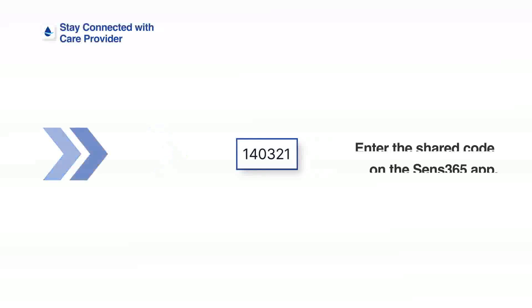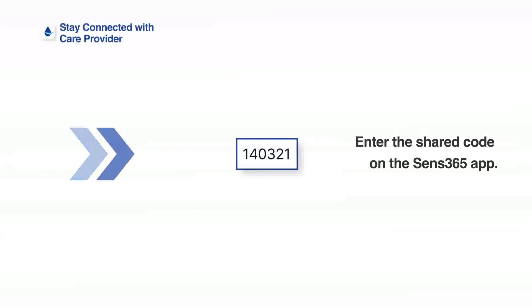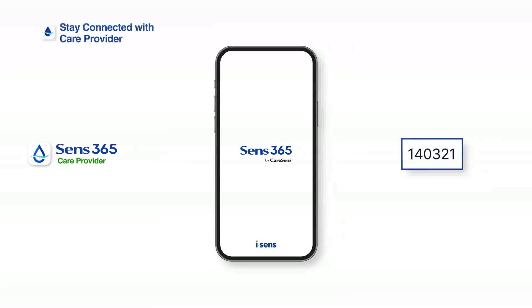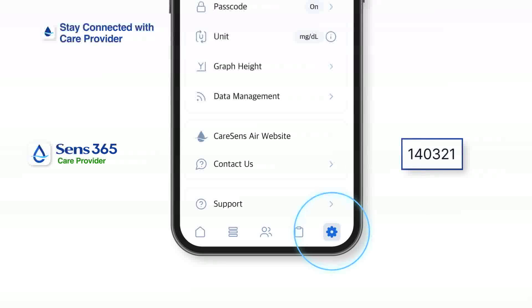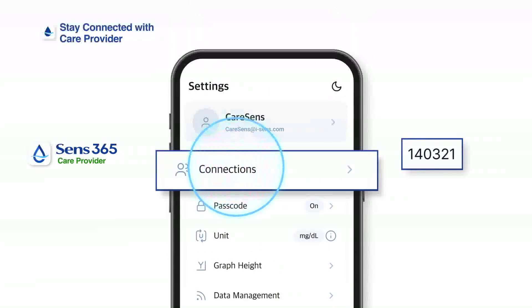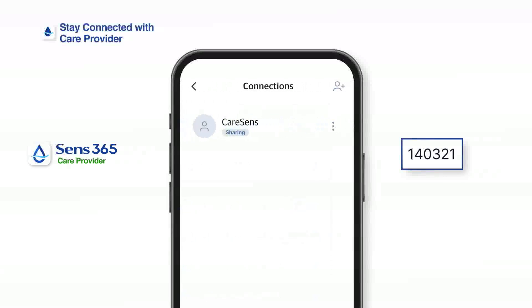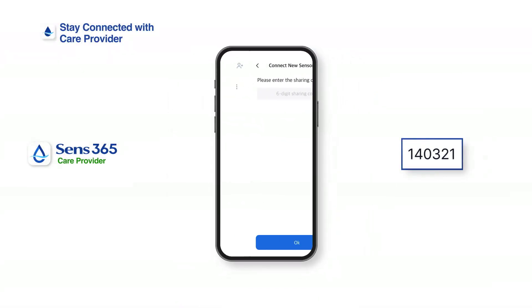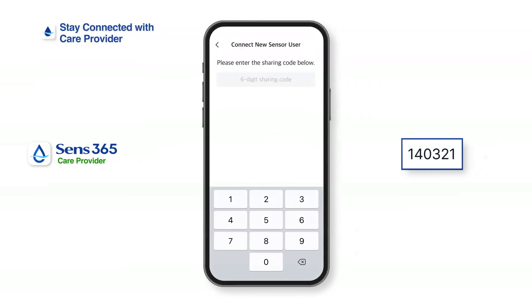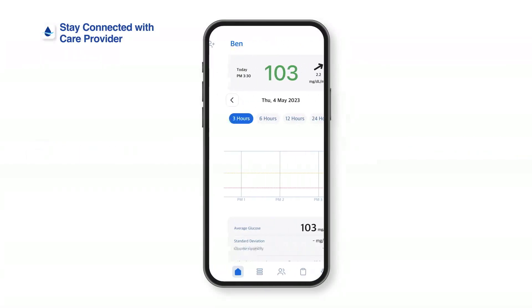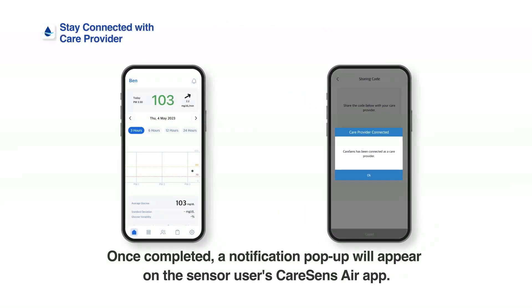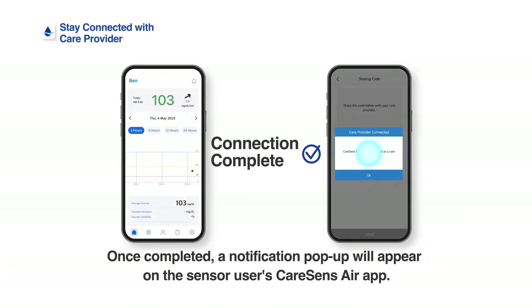Now, let's enter the shared code on the Sense 365 app. After running the Sense 365 app on the care provider's smart device, tap Settings at the bottom of the home screen, then tap Connections. Tap the Add Person icon at the upper right corner of the screen. Enter the shared code provided by the sensor user and tap OK to complete the process. Once completed, a notification pop-up will appear on the sensor user's Kerasens Air app.